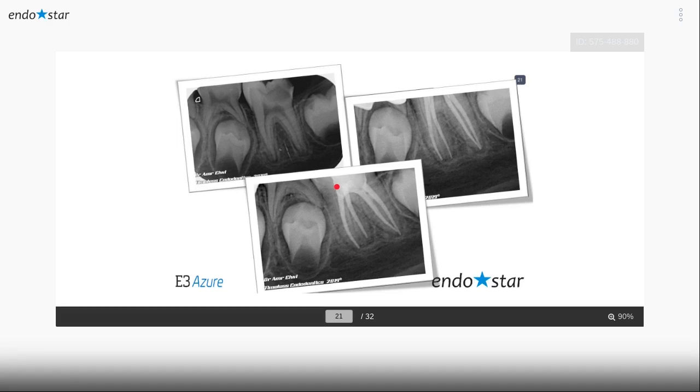And this is not the manufacturer recommendation. The manufacturer recommendation for the heat treated wires is starting from 0.8 torque up till 3.5 according to your experience. But we can say safely I use it 350 speed and 2 to 2.5 torque, especially in large sizes. You can reduce the settings in a smaller size, which I will speak about today.